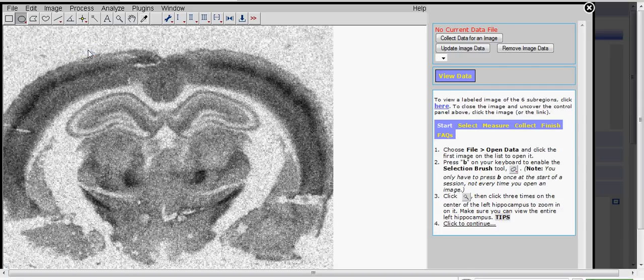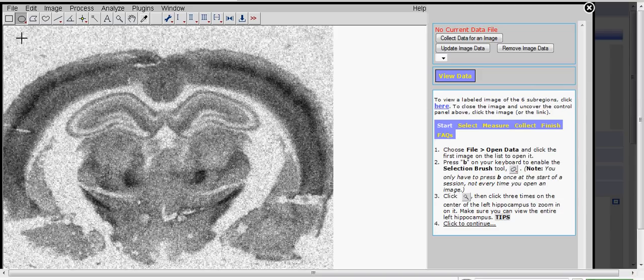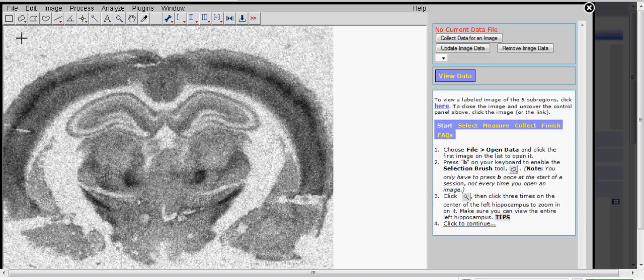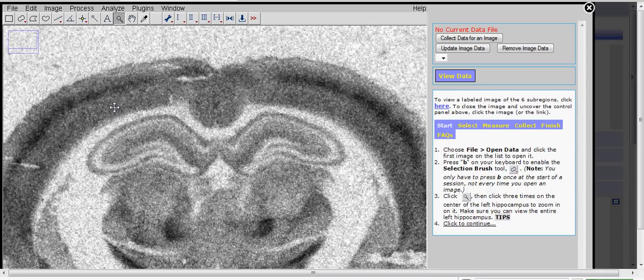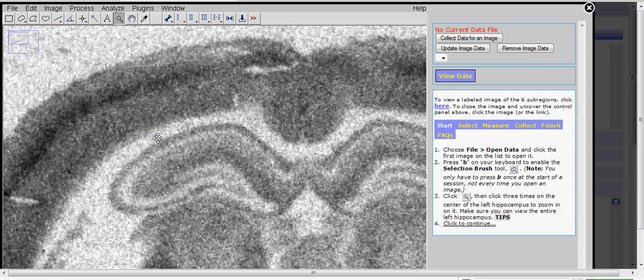Once it opens, we're going to need to change this Elliptical Selection tool to the Brush tool. We've made a macro for that, so just press E on your keyboard and you'll see the tool change. Now we're going to zoom in on the left hippocampus by clicking the magnifying tool and then clicking three times on the center of the left hippocampus. One, two, three.